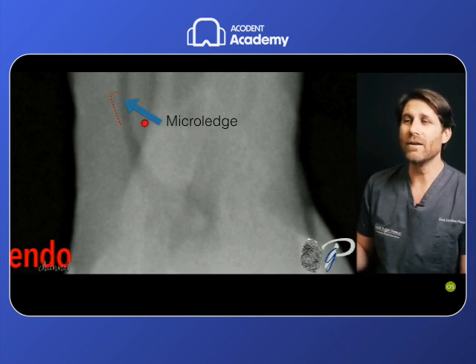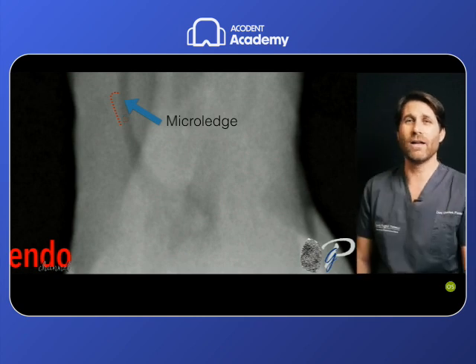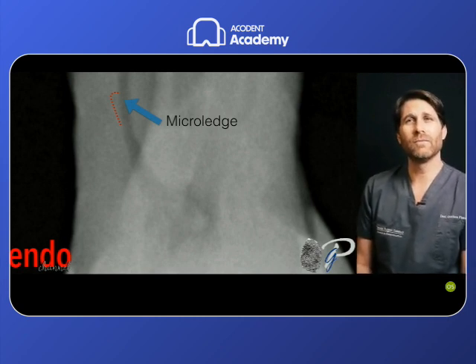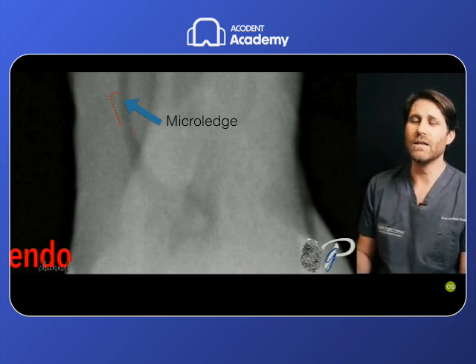It stops here, and if we work with an endo file there, we can create a micro ledge that will create a very difficult impediment for the proceeding of the procedures in these cases.